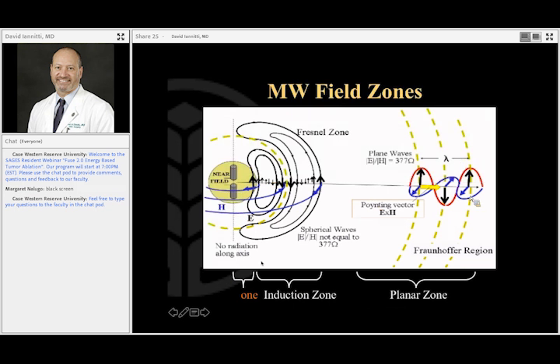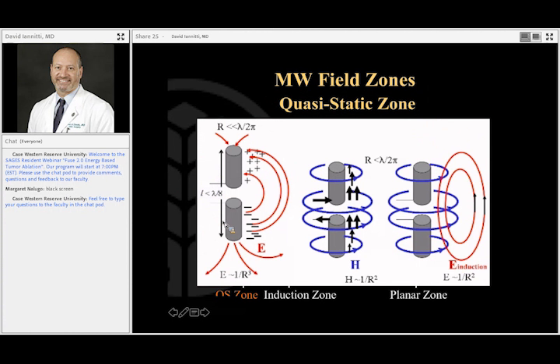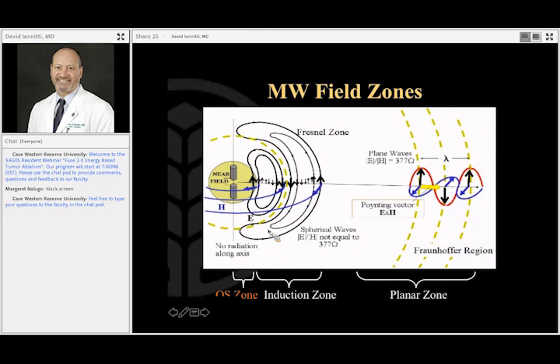So these are the different parts of a microwave as it gets emitted through tissue. And this is your antenna here, and in the immediate area near the antenna, there's crazy physics going on. You have really high energy currents, and you have really high magnetic fields there. This is called the quasi-static zone. And you have this really intense energy and magnetic field. And you can see that the electric field is going to be perpendicular to the magnetic field, and that induces a wave. Remember, you're sending waves down, positive, negative, and that really intense field is going to create a wave.